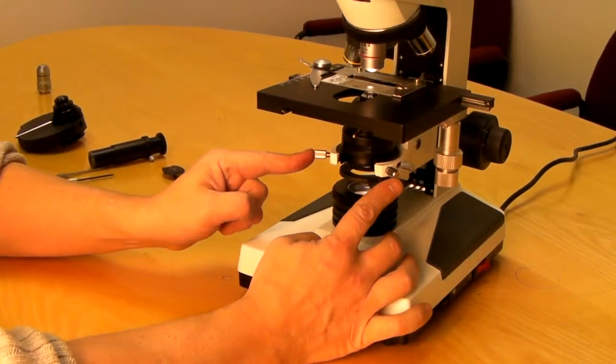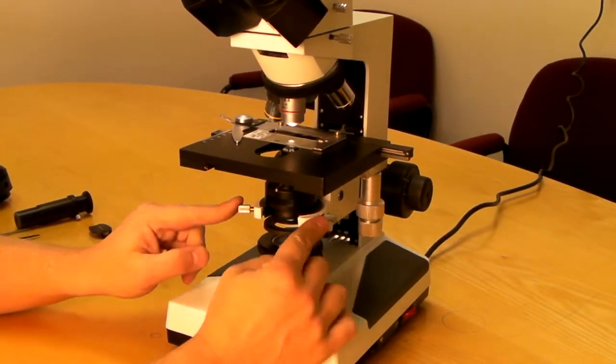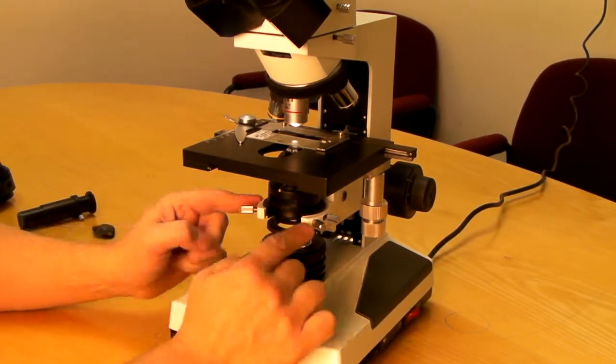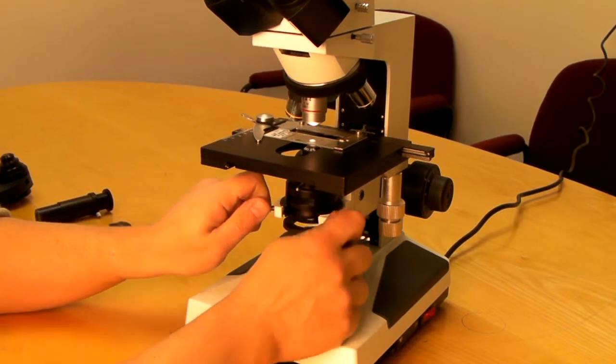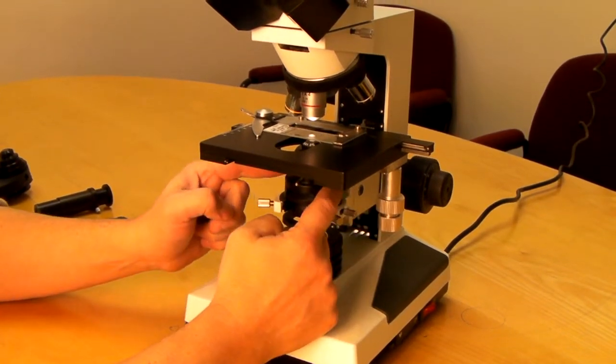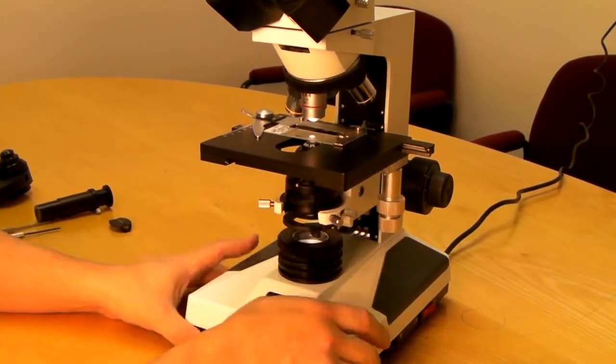Second, there's two screws that can be used to center the condenser position in its holder. By rotating both of them at the same time, you can manage to put the condenser in center.